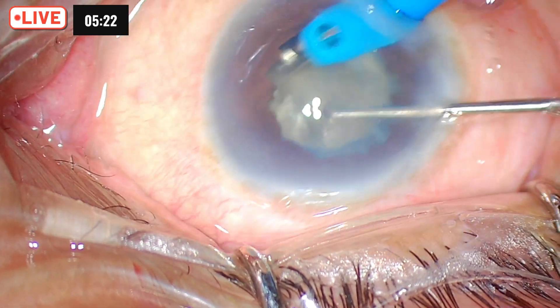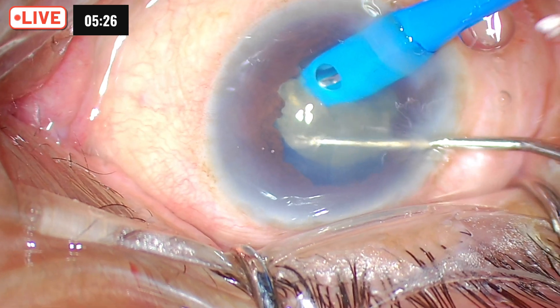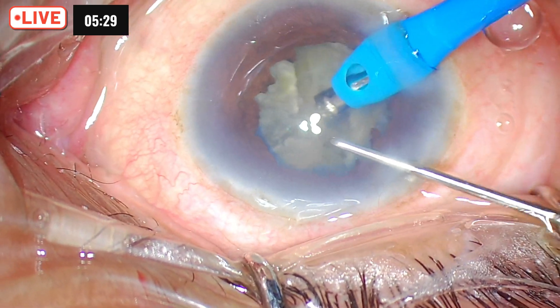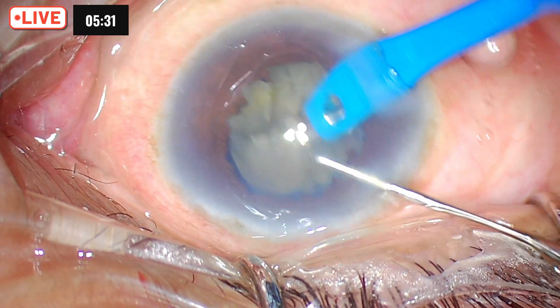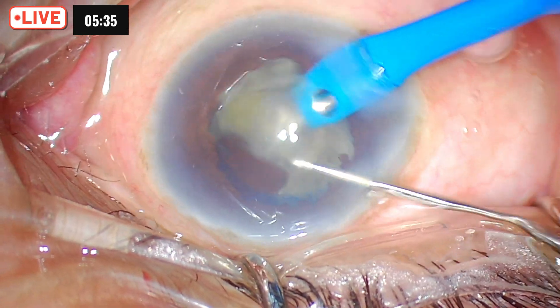You see the beauty of the chopper — in one go it has chopped the whole thing. Even when a case looks impossible, right planning, proper instrumentation, and step-by-step planning make the job a little easier for the surgeon.